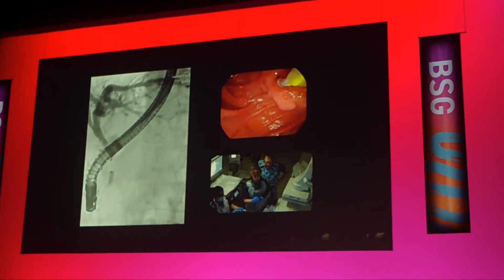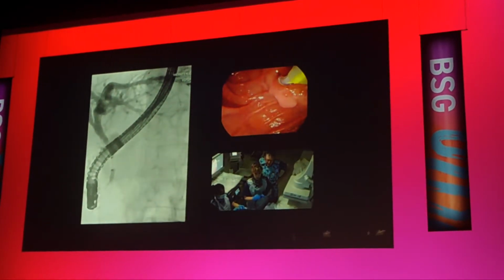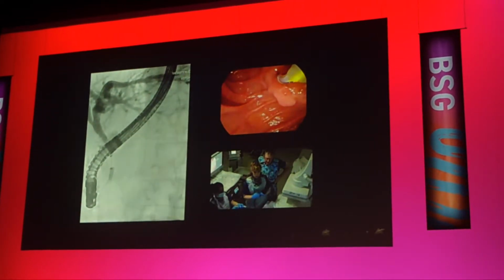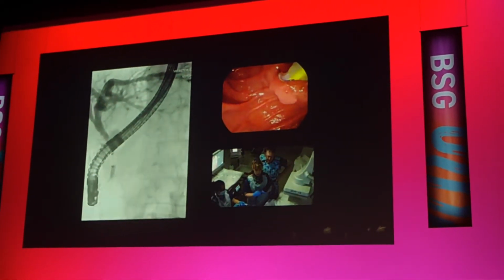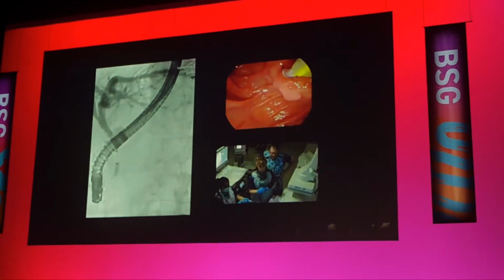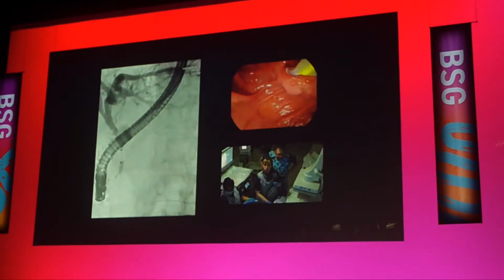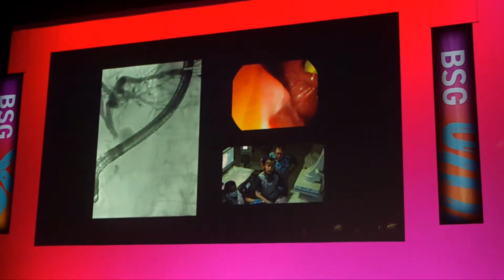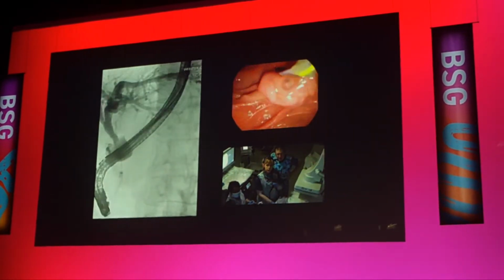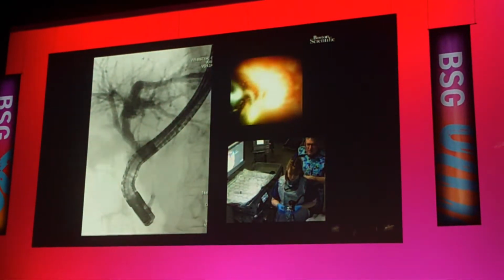So just before I play the case, you can see here the initial cholangiogram that I showed you in that first question, and it looks pretty unremarkable. You've got a balloon that's inflated below the scope and a bile duct that's been filled with contrast, and there's no strictures, no stones, but we're not seeing what's going on behind the scope. So if I now play the video, I'll show you the manoeuvre, which is to take your locks off, push in with anti-clockwise torque and inject some more contrast. You can see that there is in fact something going on behind the scope, likely a stricture, possibly a stone, but we're going to further assess that with cholangioscopy.